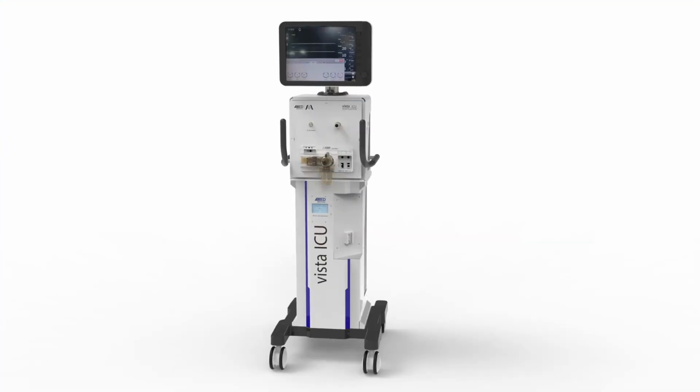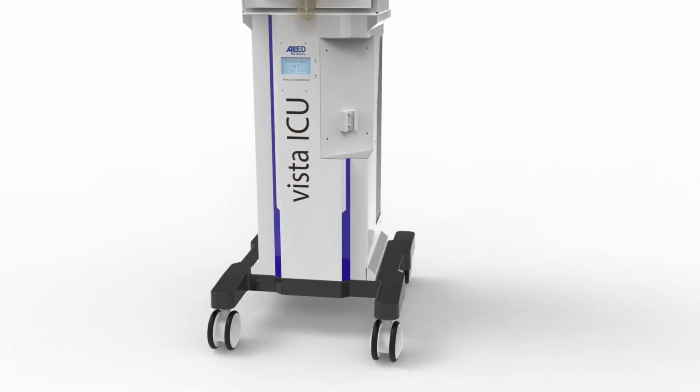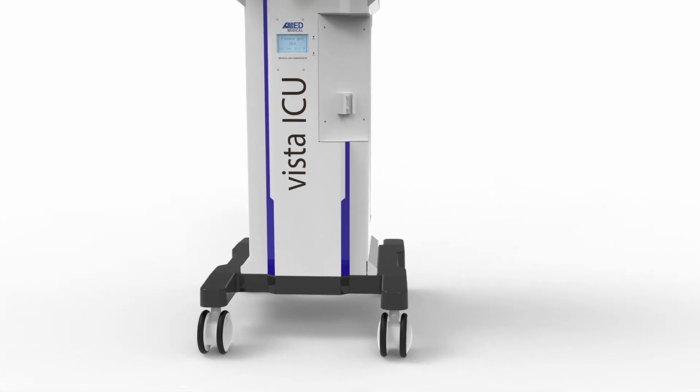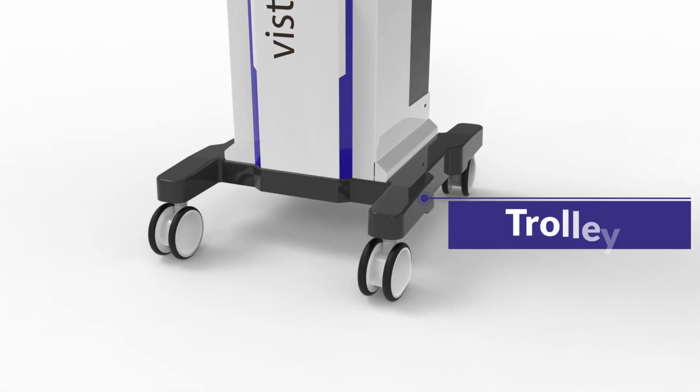Let us now understand the different parts associated with the ventilator. At the bottom, we have the compressor that provides the ventilator with a steady supply of compressed medical air. Additionally, it serves as a trolley, equipped with 4 wheels. The trolley features 2 front wheels with brakes, ensuring stability and control. Meanwhile, the rear wheels operate without brakes, allowing for easy maneuverability.